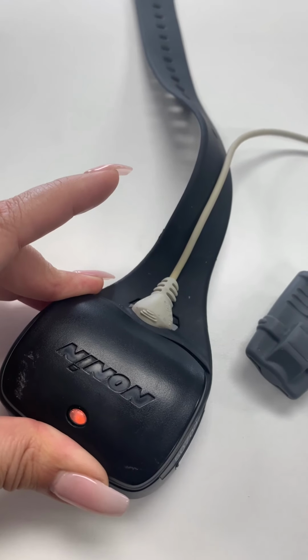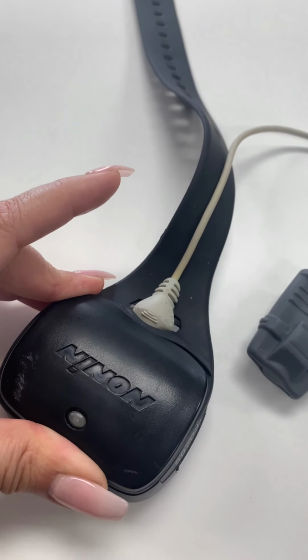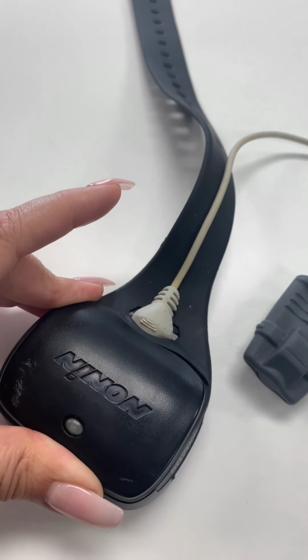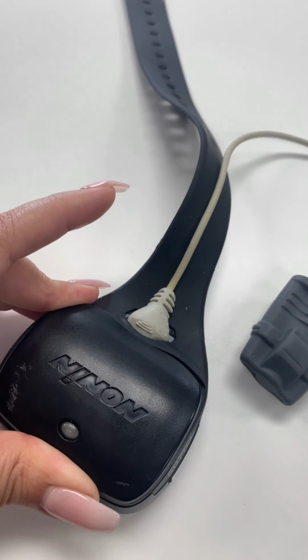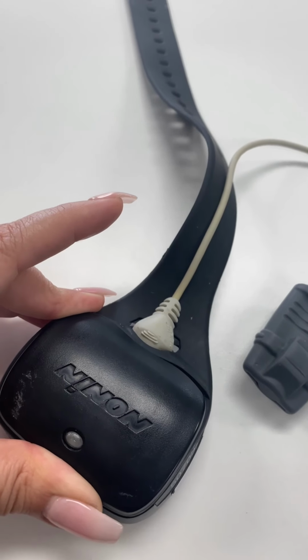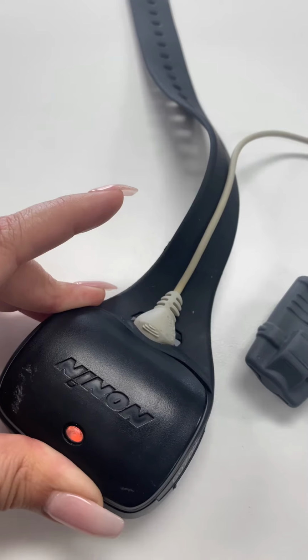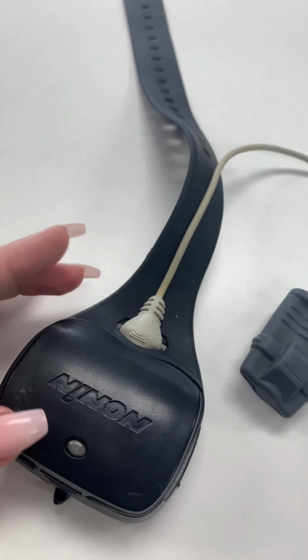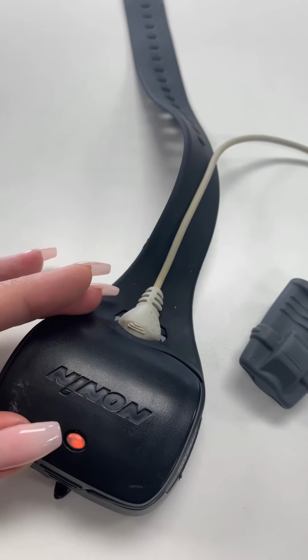The flashing light will continue flashing orange until the computer on your chest is turned on. After the computer is turned on and is recording, the orange light will turn to green.